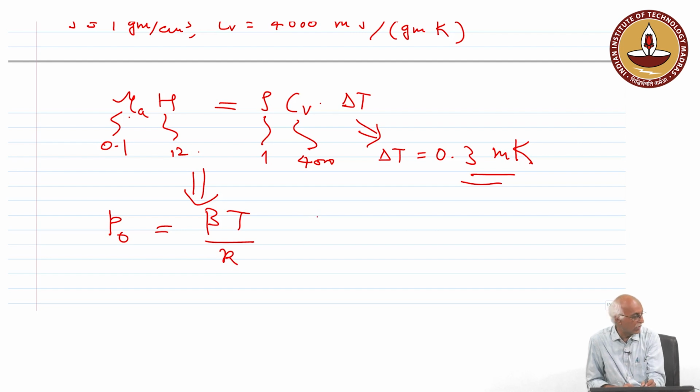Beta is nothing but... The P0 is the pressure rise, and I will tell you what beta is. Beta is related to thermal expansion.